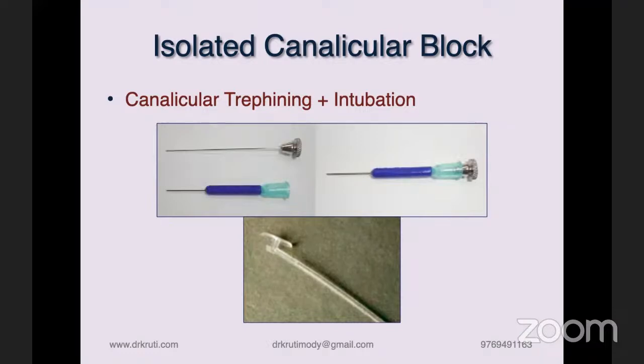When you have punched, the body is going to want to heal it. It will close it again, so always intubate. Here you can use the mini Monoka intubation, which we use in canalicular tear repair. So that is what can be used.